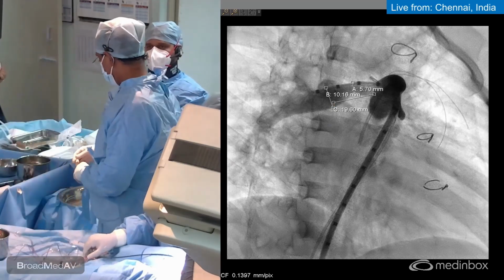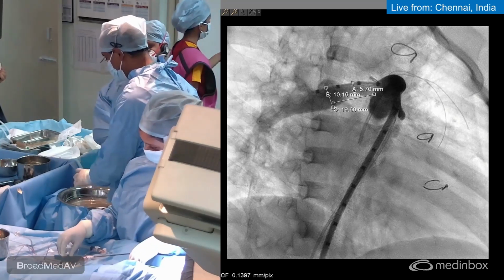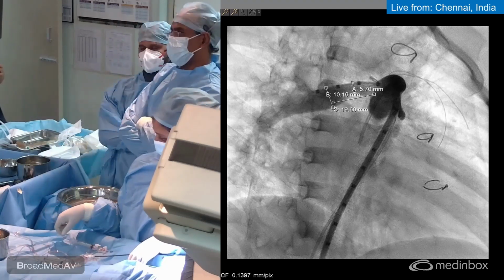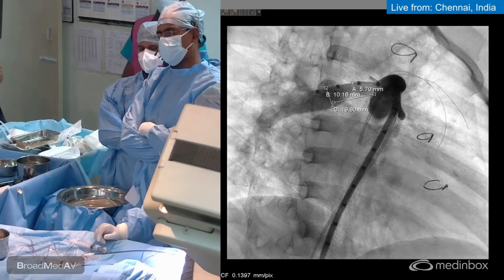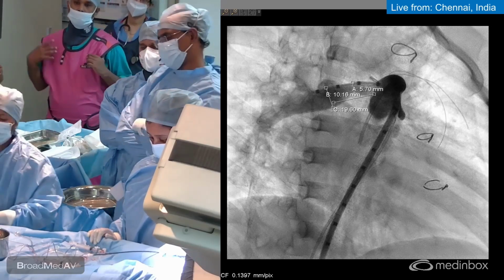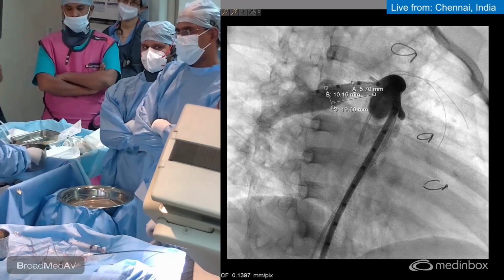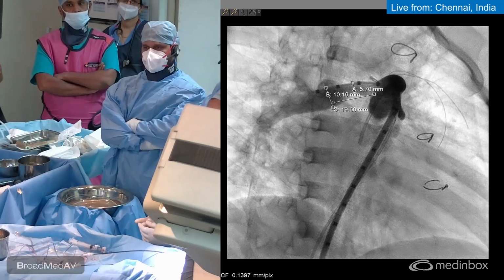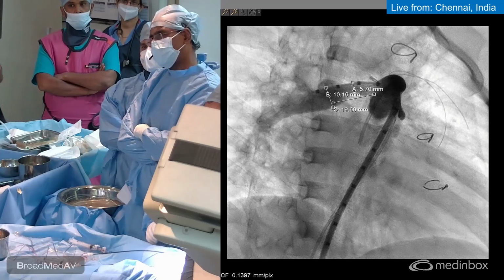So if you look at traditionally the Palmaz Genesis XD stents, which are stainless steel stents, have been the most time tested ones. Similarly, the Intra Stent Mega LD, LD Max, they have been traditional stents. The problem about these two stents is that both of them are stainless steel. So once you put in a stainless steel stent, the ability to interrogate these patients with magnetic resonance imaging in future is going to be not good.